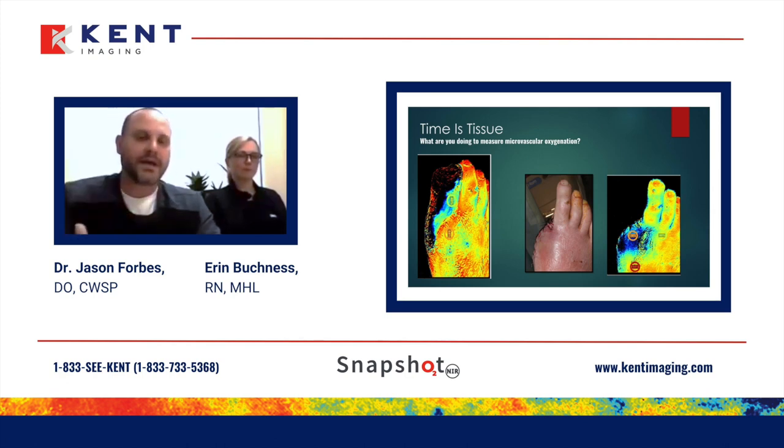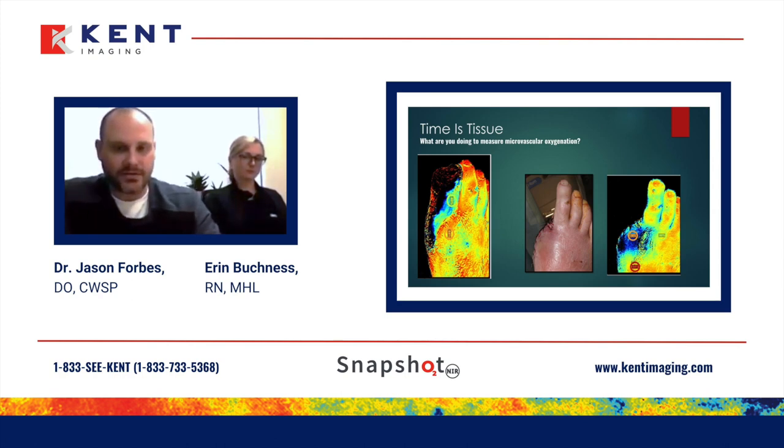If I'd see him back in a week, that's already going to be bad, but I know now, and I'm going to get the ball rolling and be as aggressive as I can. This patient, I want him urgently in the hyperbaric chamber. If we wait a week, none of that might happen, because that second toe is going to start showing some changes and eventually become gangrenous, and your outcome is going to be totally different with this patient getting the picture now versus 1 week later.